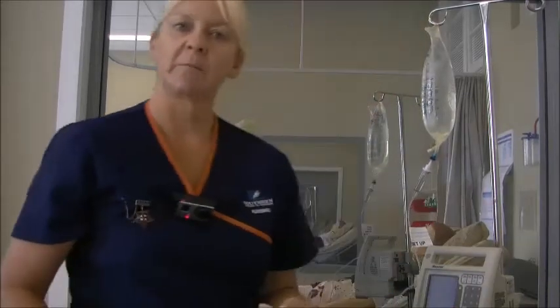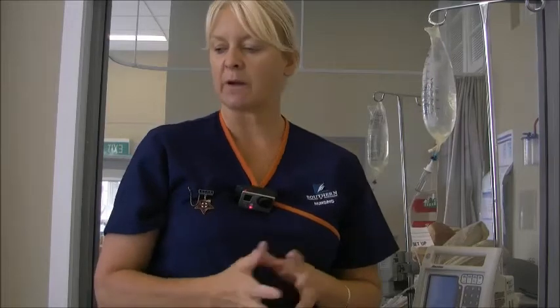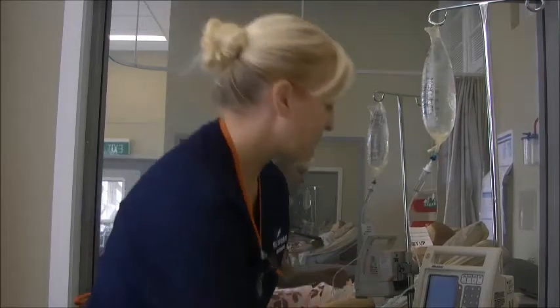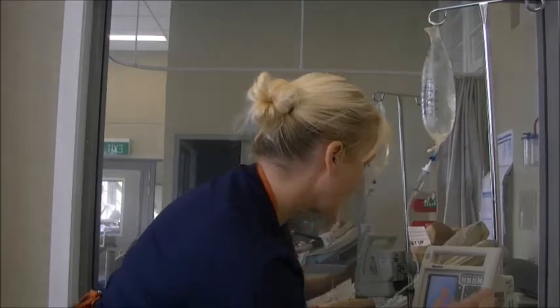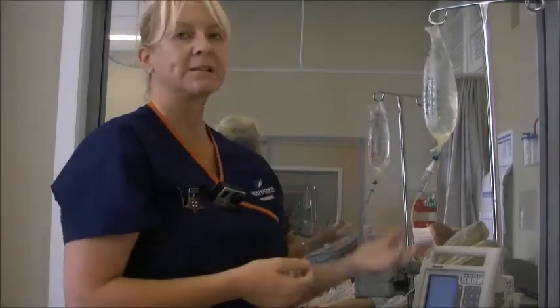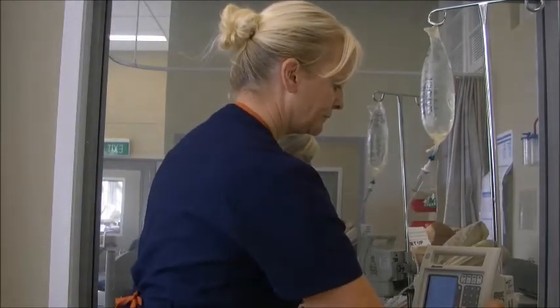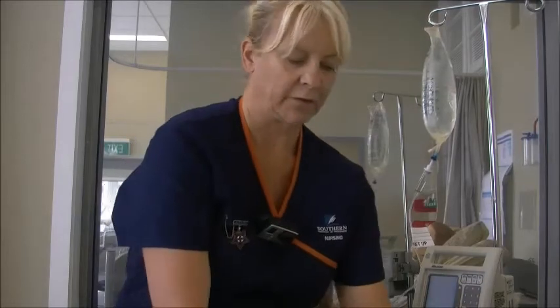and then I'm going to confirm with my RN that she's happy for me to proceed, and if she's happy that I've put the right medication, the right time, the right patient, the right route, and right, I've forgotten the other one, but you know what I mean, I'm going to press start. Okay, so that's going to start that IV. I'll just pause that now and turn that off.